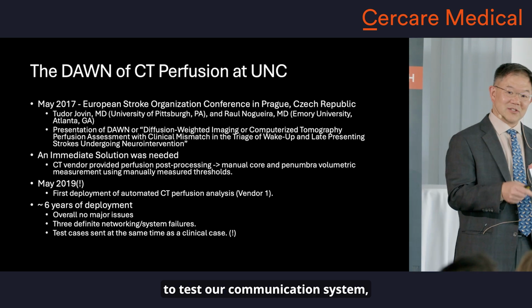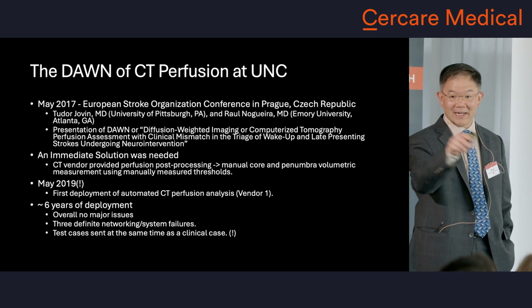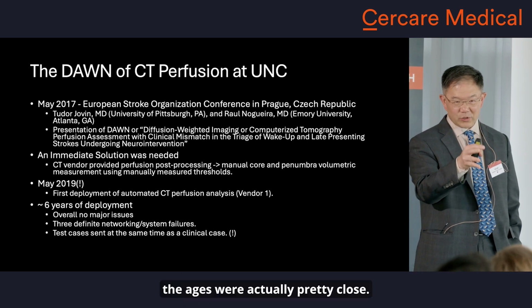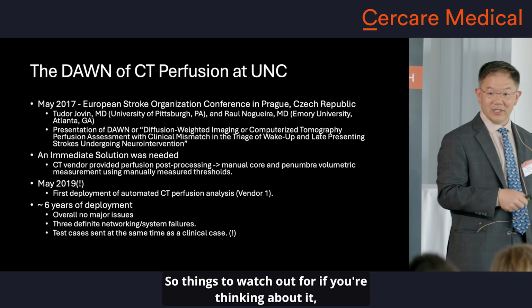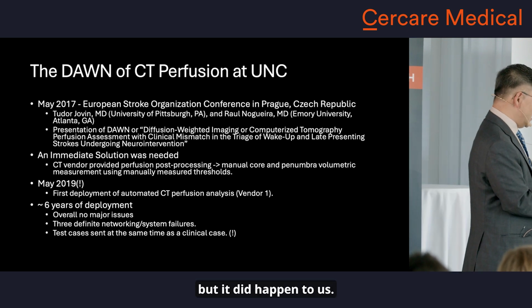And the neurologist interpreted that as the patient who was on the table. Of course, it was a male, not a female. The ages were actually pretty close. So those are things to watch out for if you're thinking about it, right? The mistake that never should happen, well, thankfully it didn't change care, but it did happen to us.